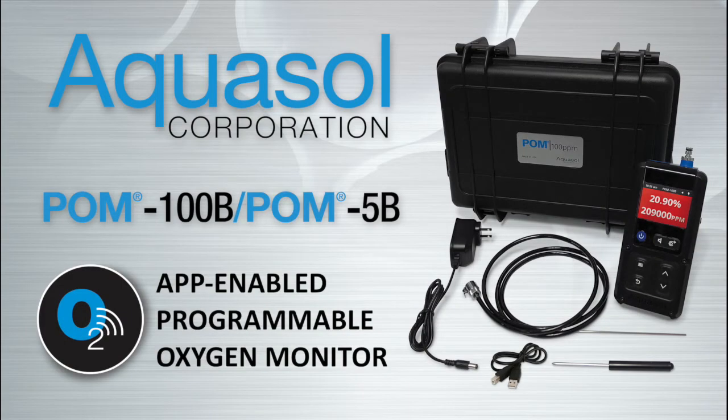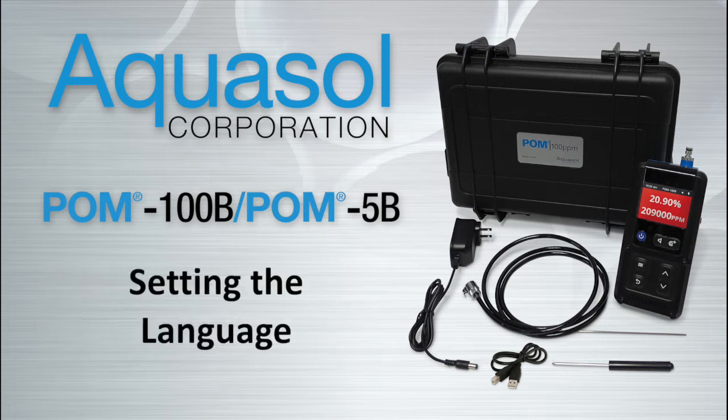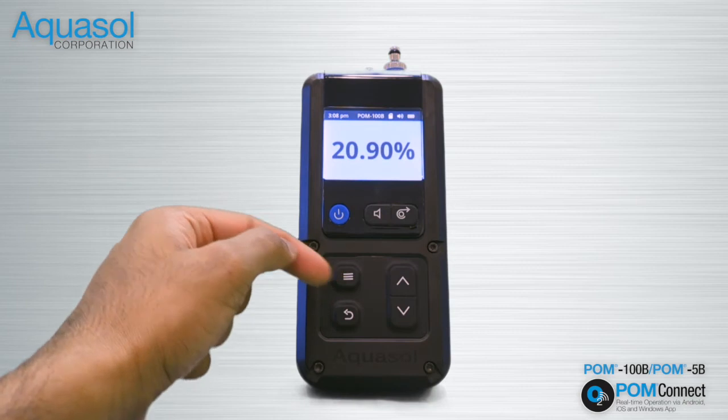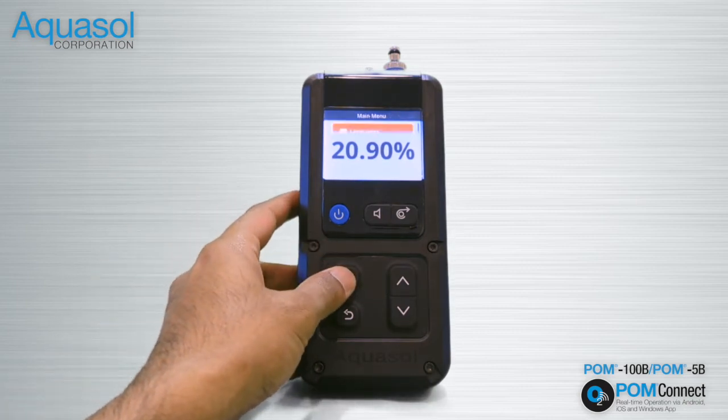Welcome to Aquasol Corporation's POM 100B POM 5B tutorial for setting the language using the POM device. After powering up the POM device by pressing the blue button below the screen, press the menu enter button.